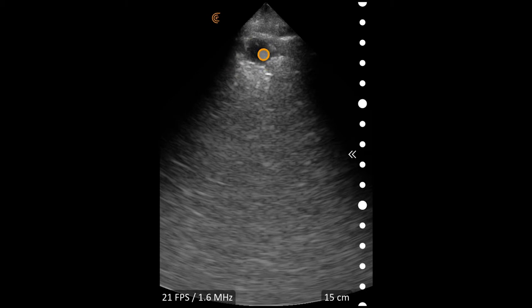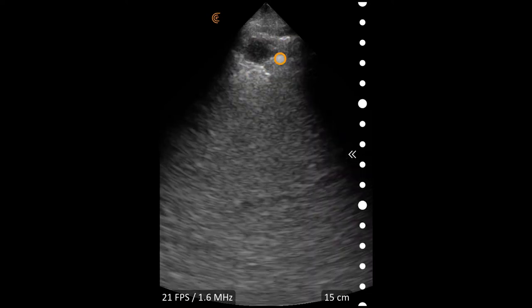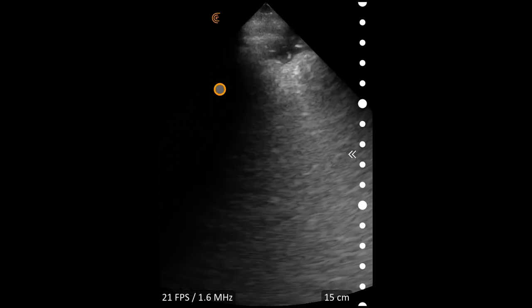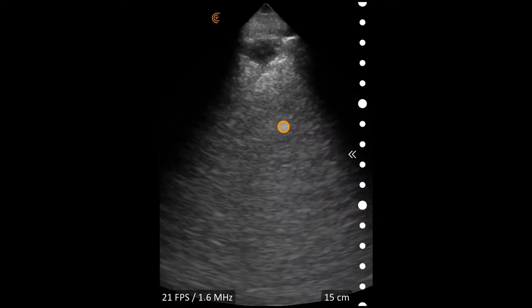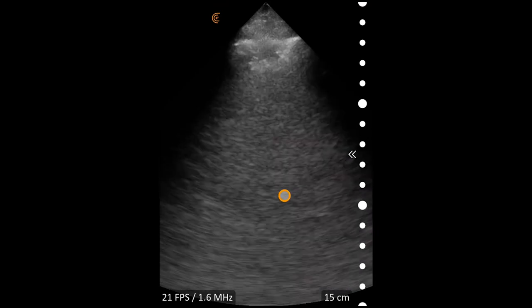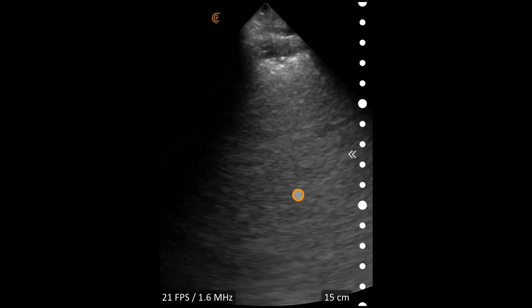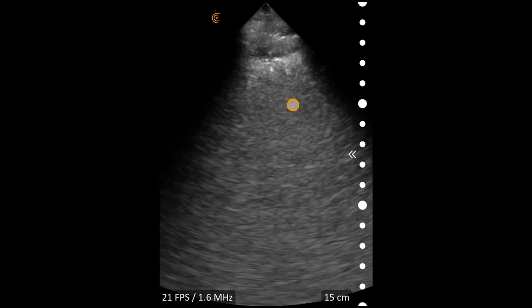Just deep to that pleura is a fluid collection with a ragged thickening edge of the pleura below it, suggestive of a sub-pleural consolidation. As you can see, the A lines below or deep to that are completely obliterated.